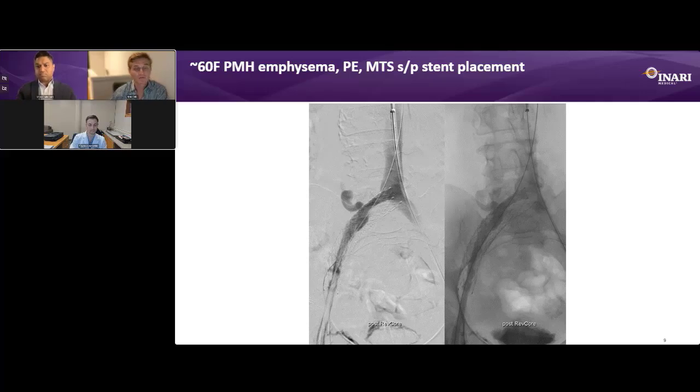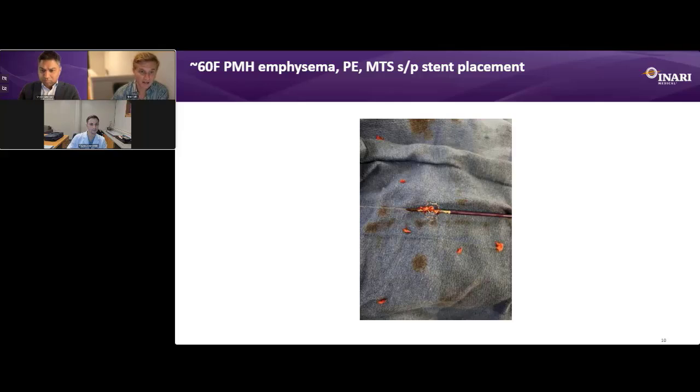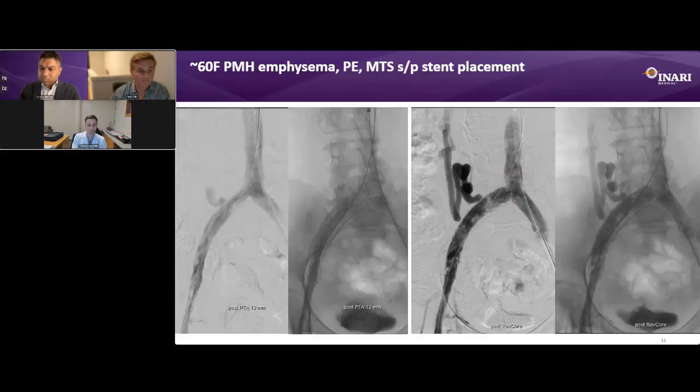We did put up the FlowTriever 1 catheter with the 3 discs from the right side, and we then did our first safety pass of RevCore, and then dialed it up to 0.5 with intermittent aspirations with the Triever catheter, and slowly dialed it up. And you can see this is kind of the junk that we're getting off, and it was well maintained and trapped in the RevCore device. There's a lot more than this. This just happened to be the one picture that we did capture during the case.